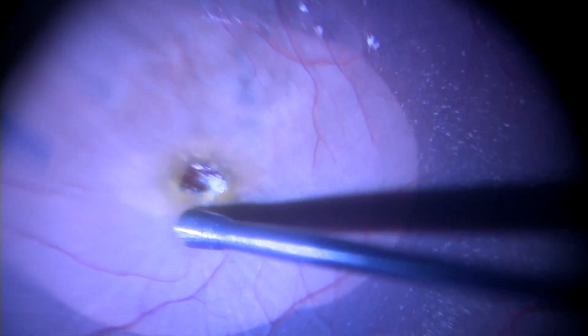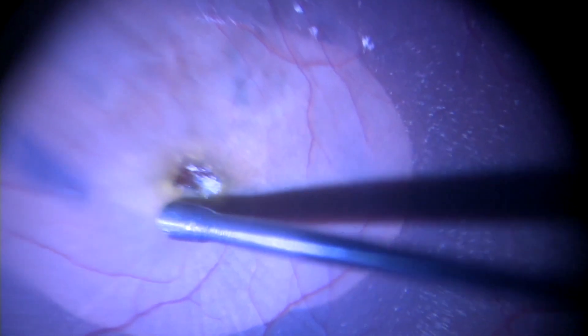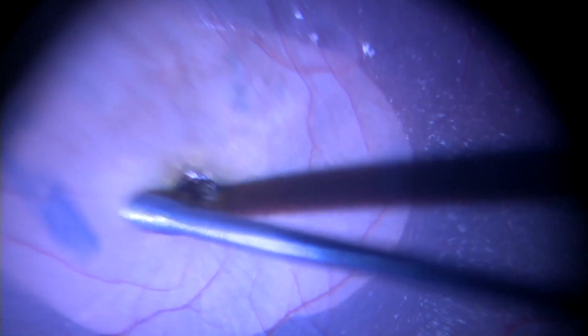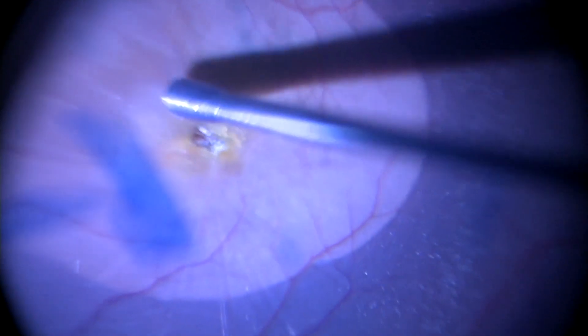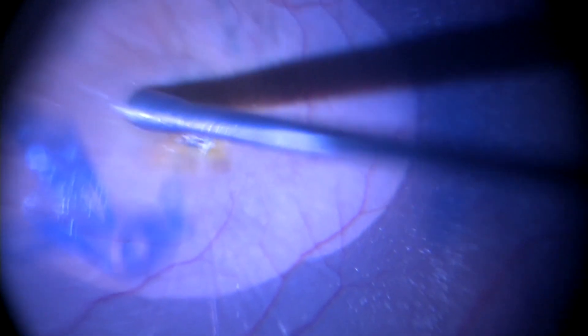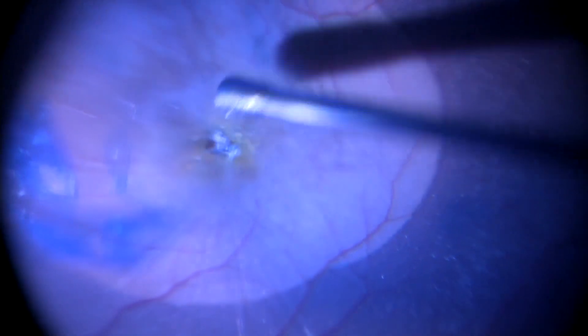This is a case of a traumatic macular hole. After an ILM peel, the massager is used concentrically around the hole. Once again, the hole reduces to a pin point size by the end of the surgery.